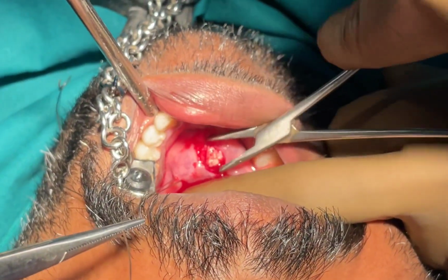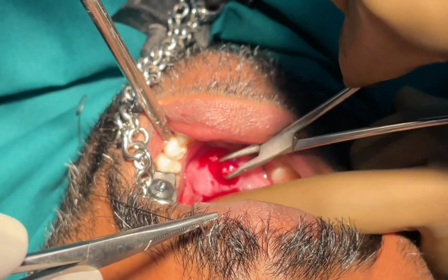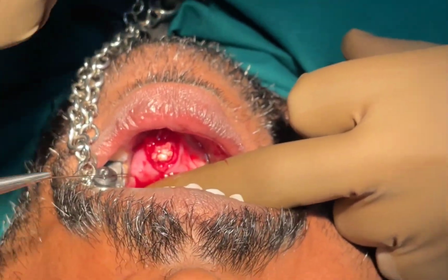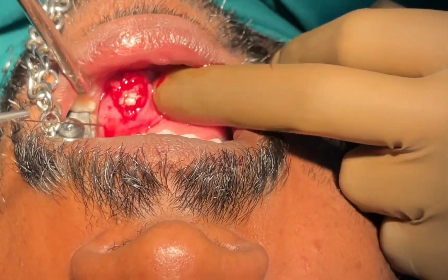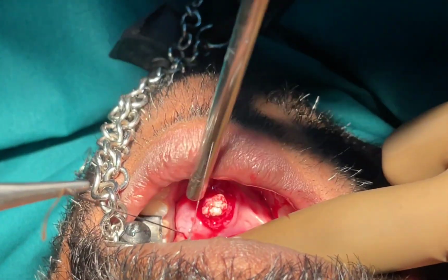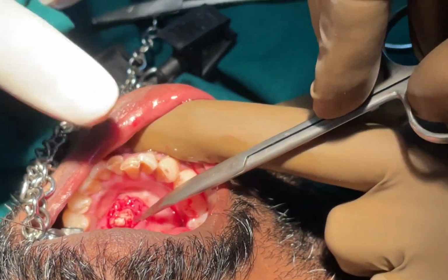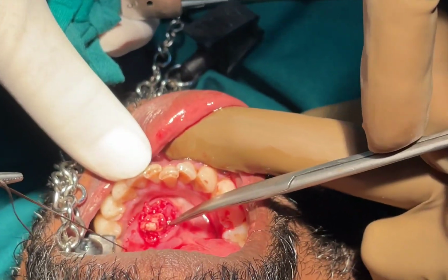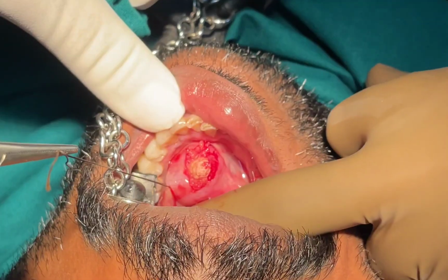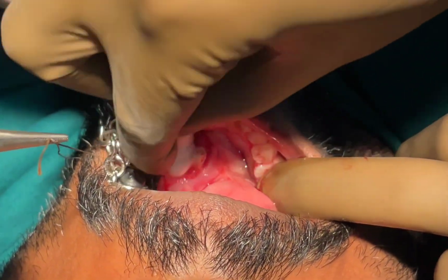So now I have just switched from a sharp dissection to using a mosquito artery forceps, and each and every time I'm trying to see that the stone doesn't dislodge posteriorly. I'm trying to pull the stay suture up so that the stone will be pushed forward. So now you can see the opening is made slightly wider so that the entire stone can be taken out in one piece. Hold the stay suture firmly so that the stone doesn't get dislodged posteriorly.